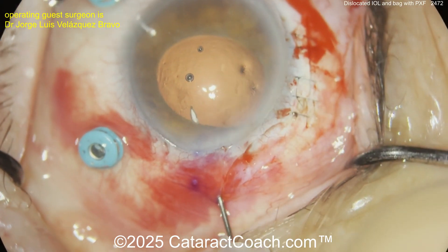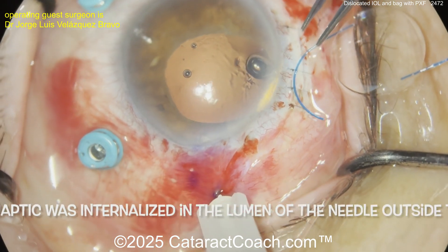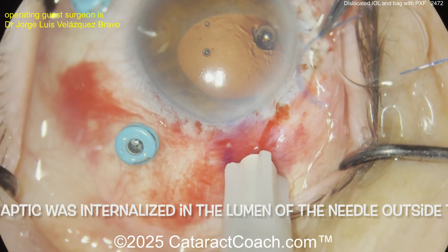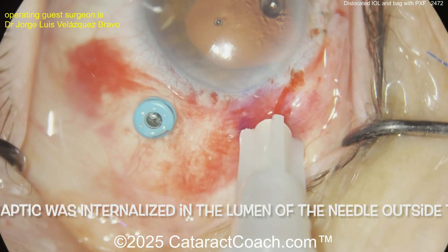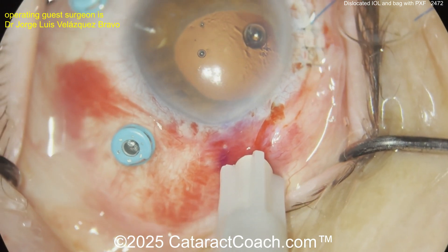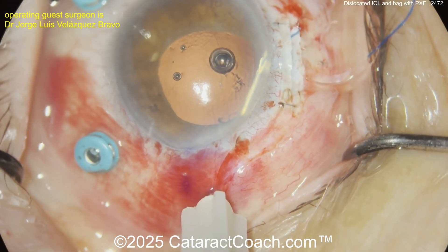This is a very nice technique. With that larger incision, it's going to be a lot easier to place the lens. You can even externalize the guiding hollow-bore needle through the main incision. Look how easy it is to thread that haptic through there — much, much easier. Get that haptic threaded through and done outside the eye. Now pulling it back inside the eye, and because you have the larger incision you don't have to worry about folding the lens.